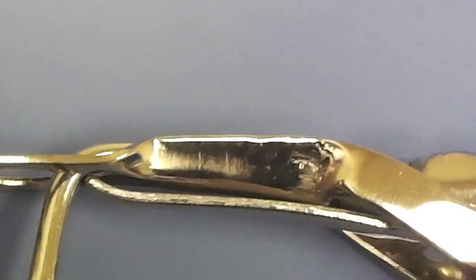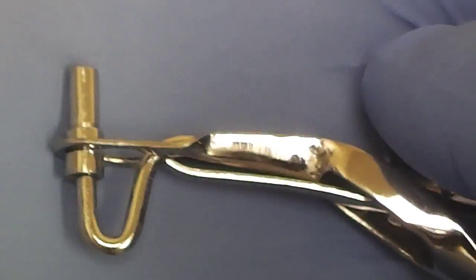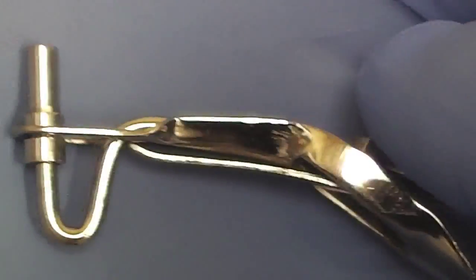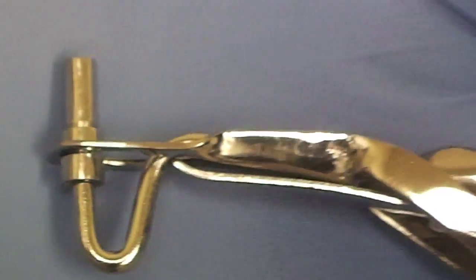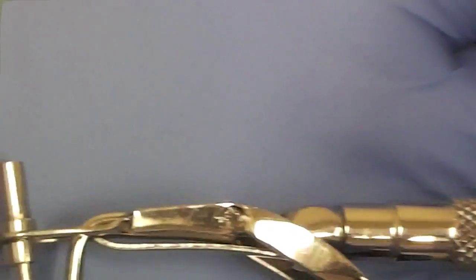This is the next instrument I'd like to discuss. It looks like an amalgam plugger, but it's actually stainless steel and it's quite hefty. It's used to pick up bone graft material and then force it into the osteotomy. The compacted bone graft material can then be forced by the pluggers to lift the sinus up.